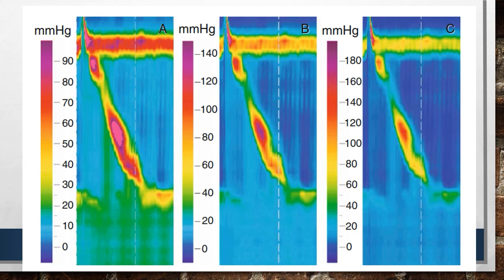You can change the amplification of high-resolution color contour. This is useful to detect subtle changes.